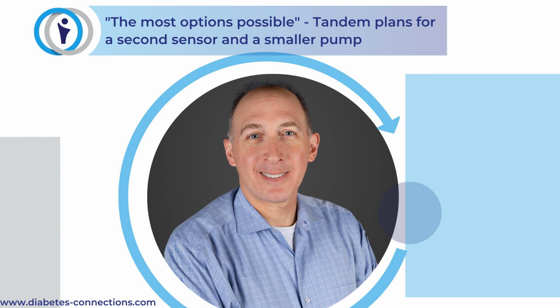And it was one of these things that, boy, if you could avoid lows, and many of the lows throughout the day and especially overnight, again, you start to see all these quality of life improvements. And Basal IQ was the first device out there on the market where you didn't have to reactivate Basal IQ. You turned it on once and you forgot where the setting screen was because it's on and it just worked. And it came out with the G6 and nobody was doing finger sticks quite as often. And then it really changed everything when that happened with the Dexcom sensor.